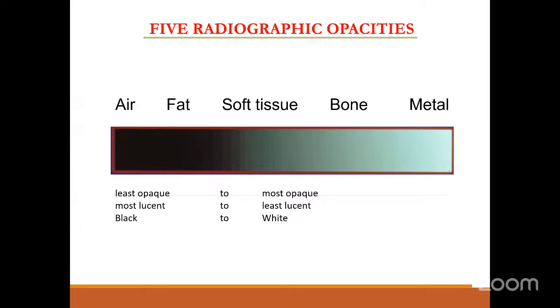We all know how an X-ray is taken. We have an X-ray machine which throws X-ray beams over to us, and we have a film which captures these beams. In between, the medium through which these rays are passing will impart some changes which we capture as an image on a film to interpret the various conditions.